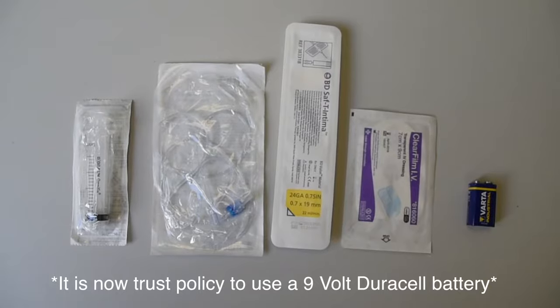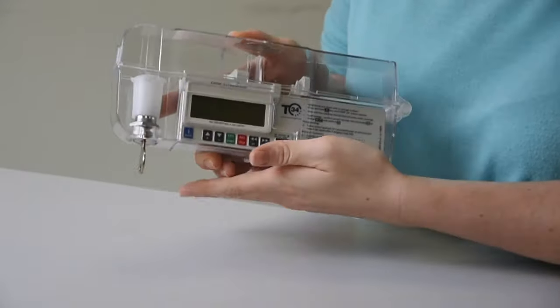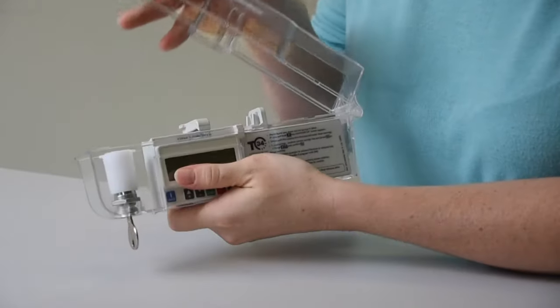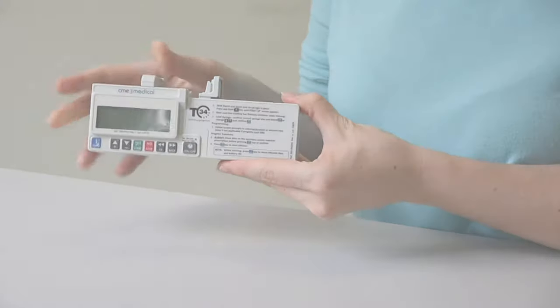Each pump should be in a clear locked box. A protective bag may also be provided. Please remember that each pump must be returned to the palliative care team once it is no longer in use.